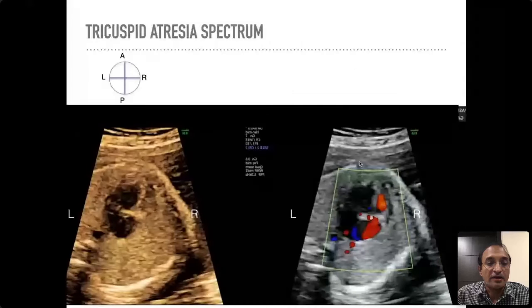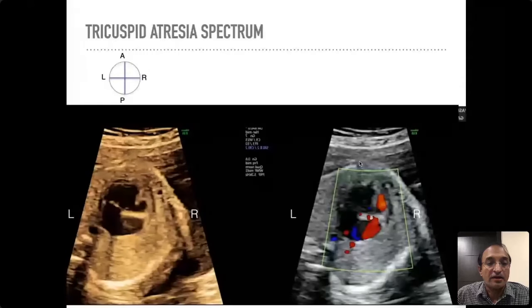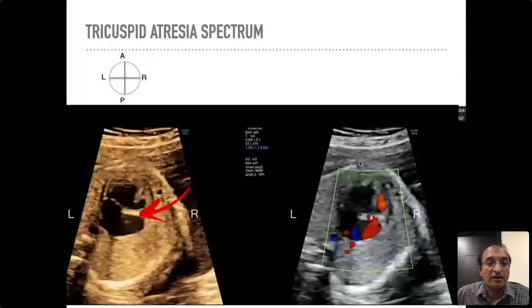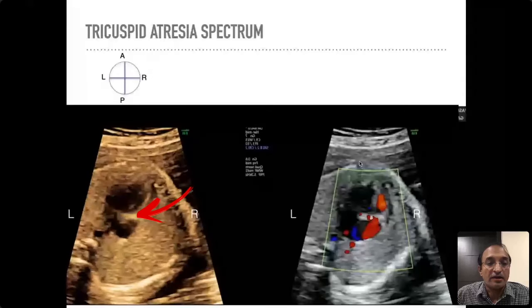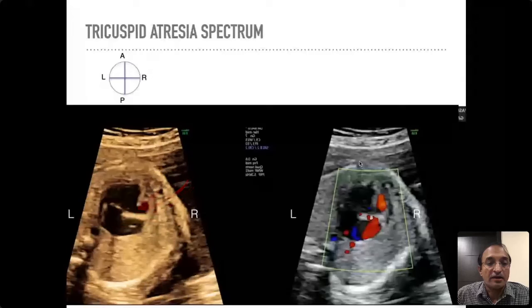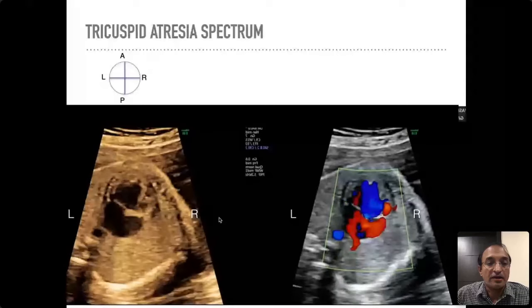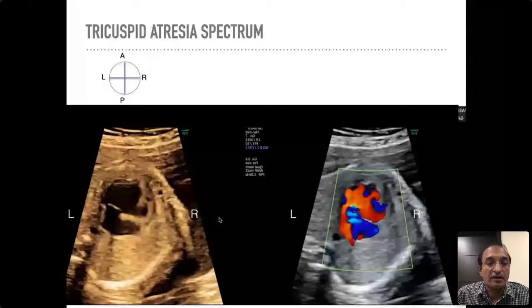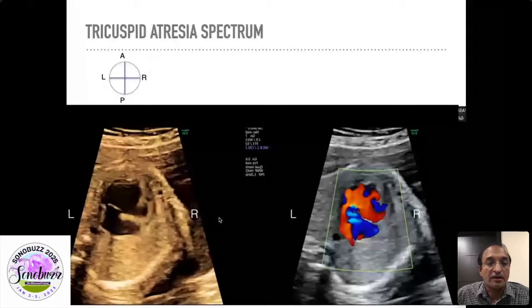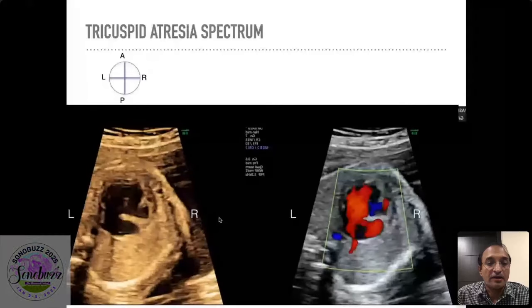Here is another entity where the right ventricle is very small. The right-sided valve is not opening at all, there is a large ventricular septal defect, the left-sided valve and ventricle are quite normal, and there is a large ASD as well. This is an example of tricuspid atresia with a large ASD — another common condition, tricuspid atresia with hypoplastic right ventricle.